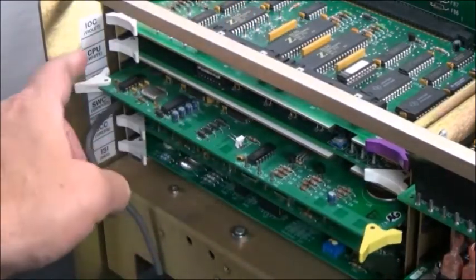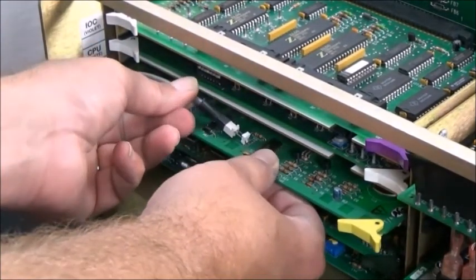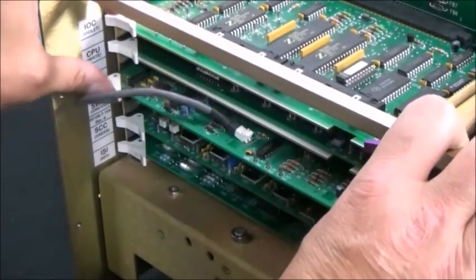Be sure to put the PPI board back into the PPI slot, not into the empty SWC slot right below it. And make sure it's fully seated. Sometimes it's a tight fit.